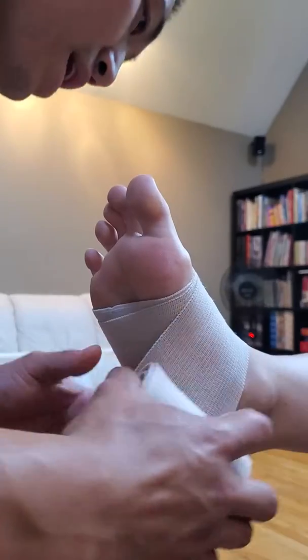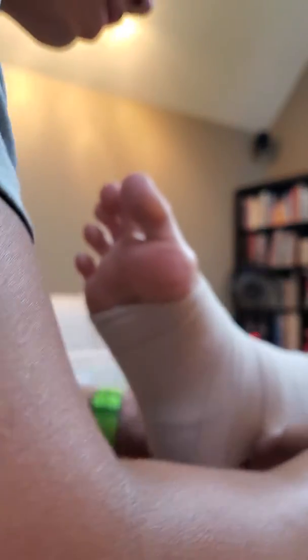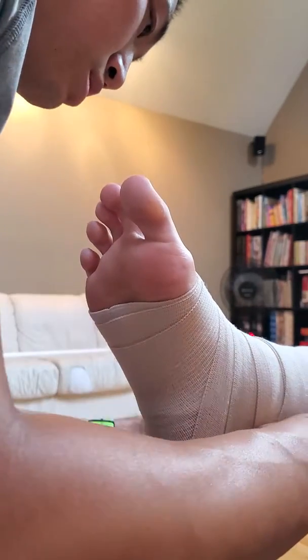After that, we're going to start making X's on the client's ankle. You'll come up, then go down, then come around, then go up, down, up, down, and then one more to close it off.